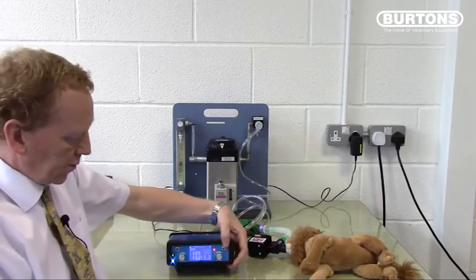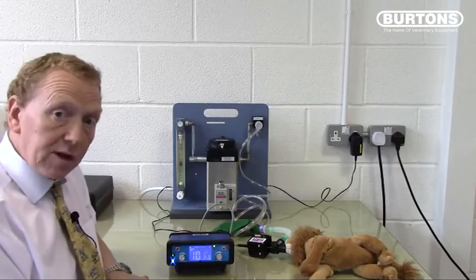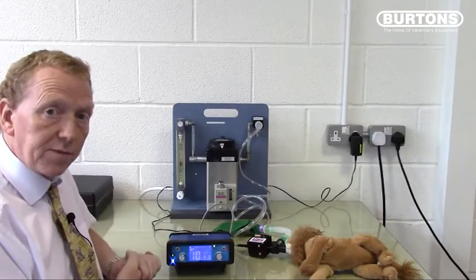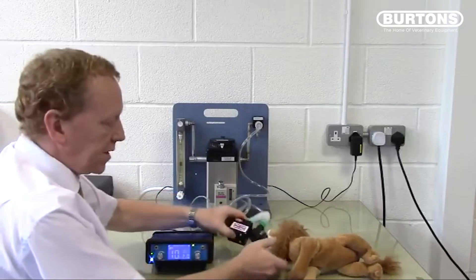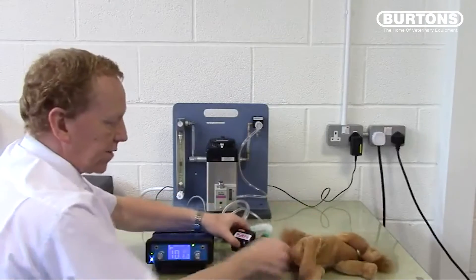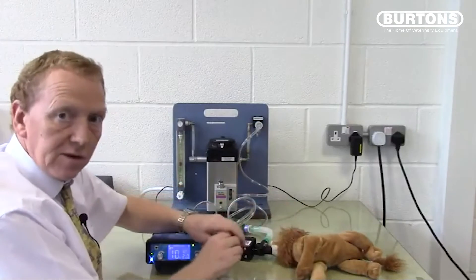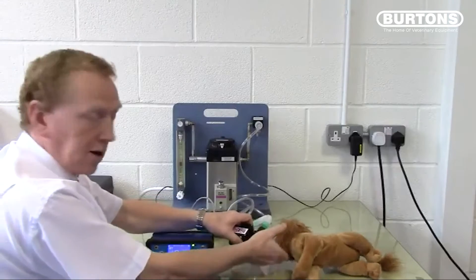To stop ventilating, press the IPPV button. One thing that can be constraining when using the SAVO4 or SAVO3 is the proximity of the patient to the valve — moving the valve inevitably moves the patient, which is difficult particularly for small patients. In those instances, you should use the SAVO3 or SAVO4 extension kit.